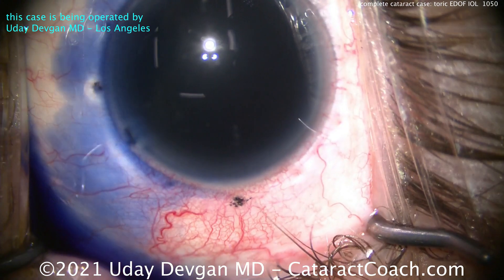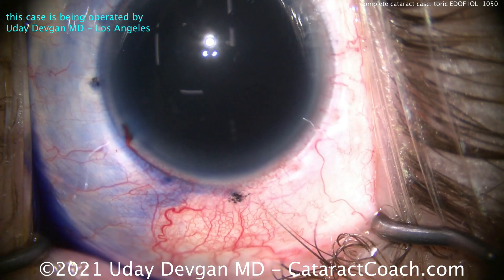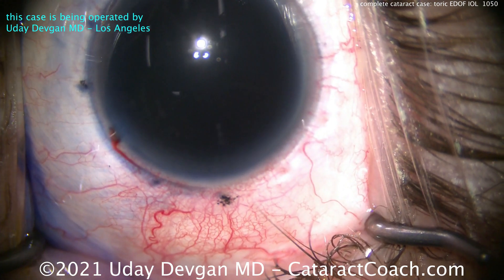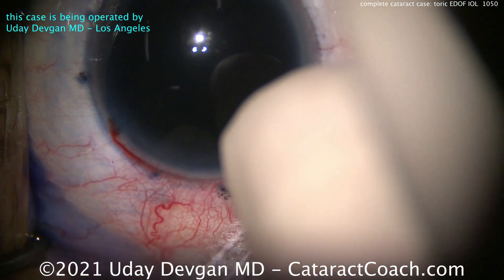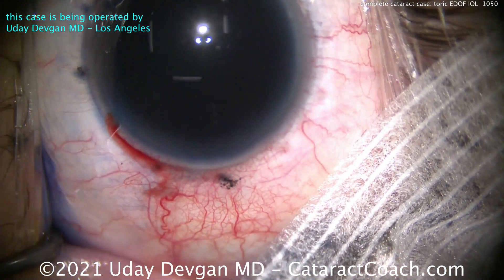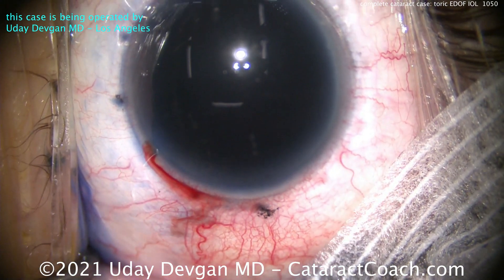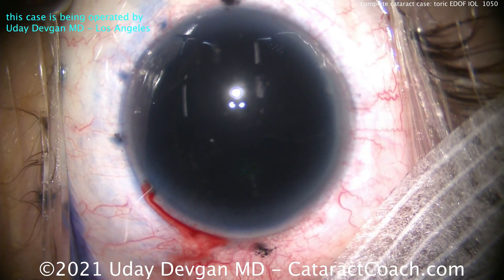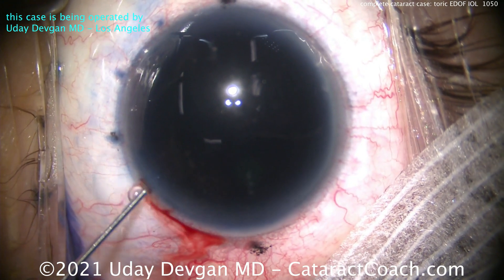You can see it's quite an opaque cataract. We're putting in some trypan blue dye which is going to help stain that lens capsule — it also makes the lens capsule a little bit less elastic. We're placing a steri-strip here to get some of those eyelashes out of the way. We want to keep our field nice and clean, no eyelashes in the way, so that steri-strip is quite helpful.